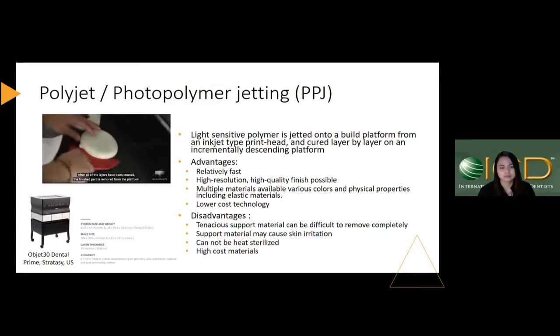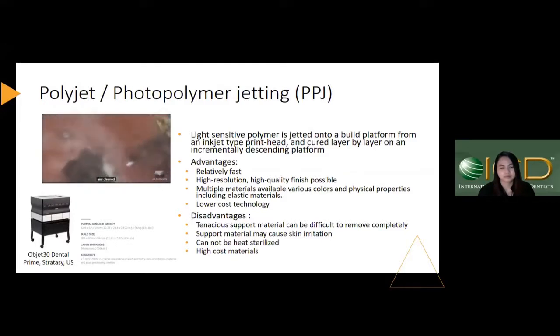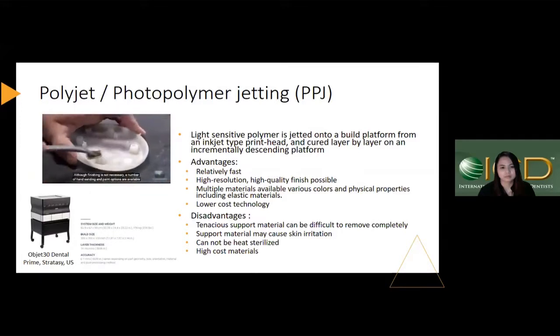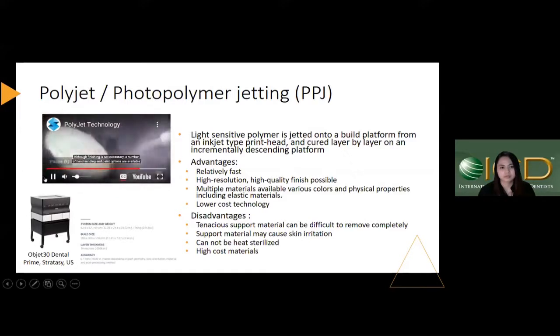After all of the layers have been created, the finished part is removed from the platform and cleaned. Although finishing is not necessary, a number of hand sanding and paint options are available.